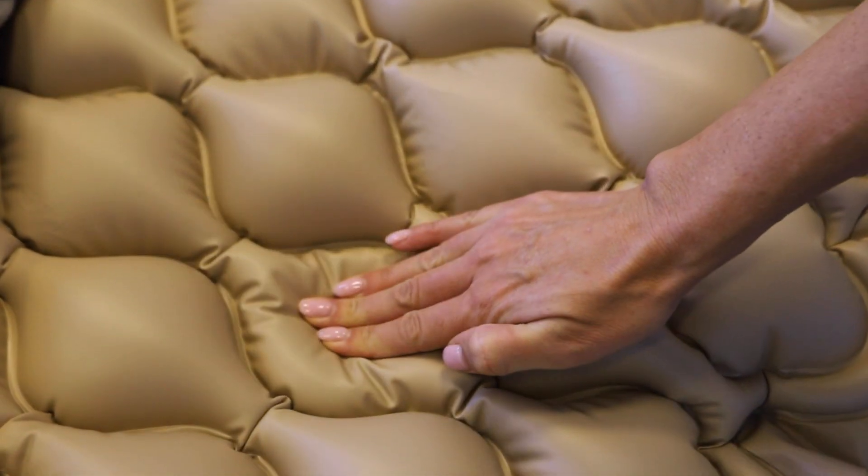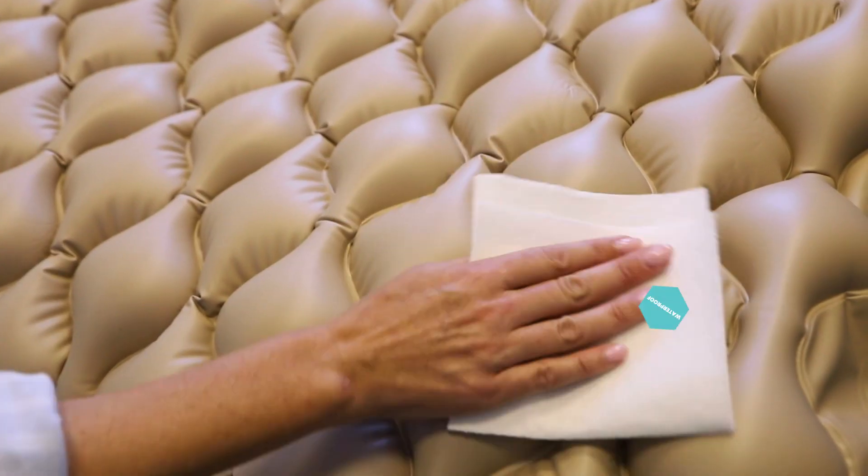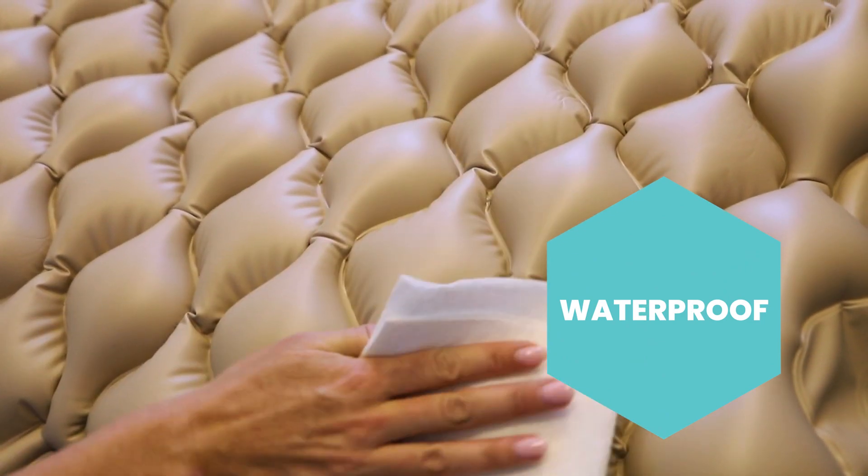The alternating pressure mattress is easy to install and use and fits all beds. The durable vinyl material is waterproof, durable, and easy to clean and maintain.